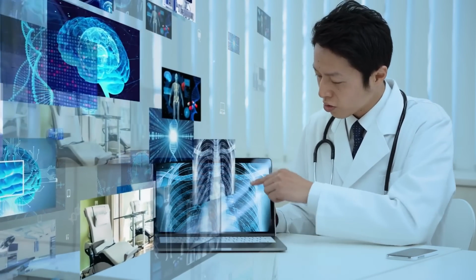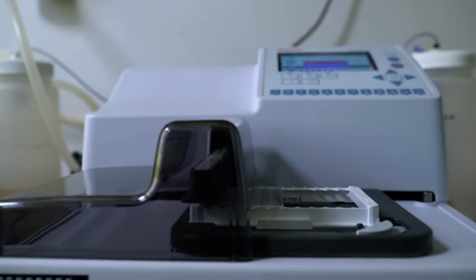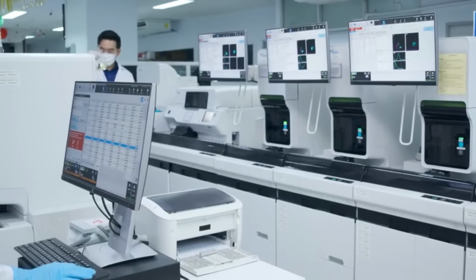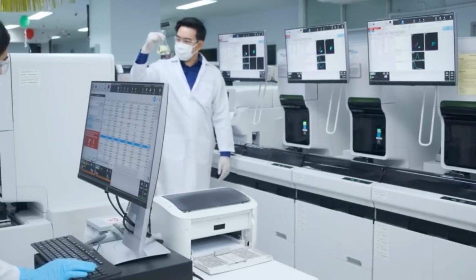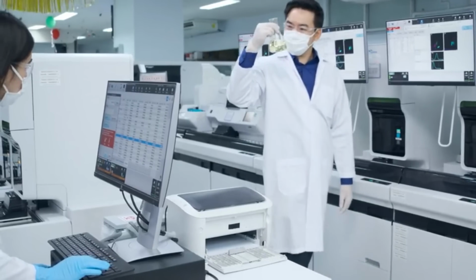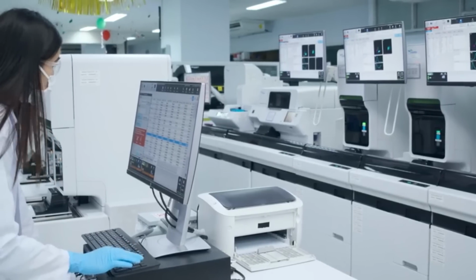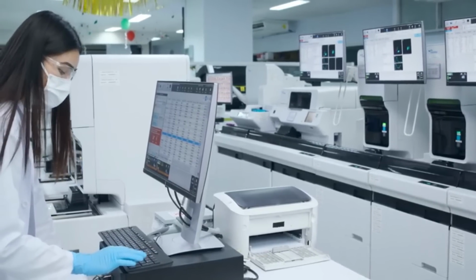Common spectrophotometers are single-beam models for microplates, cuvette samples, and continuous flow analyzers. Higher-end instruments offer features like dual wavelengths, kinetics mode, etc. Hematology analyzers integrate components like flow cells, hydrodynamic focusing, and impedance technologies for automated cell analysis.